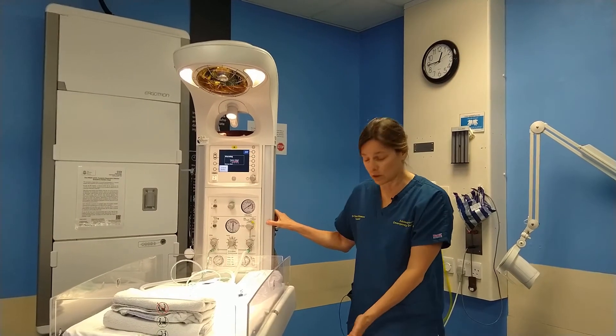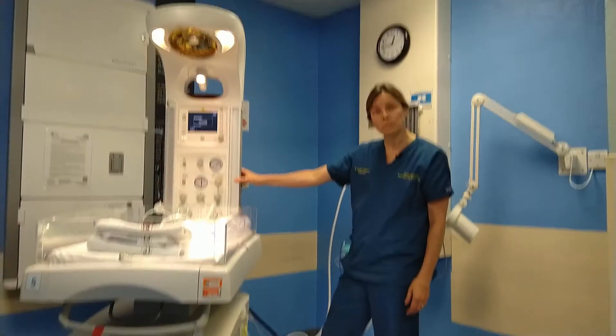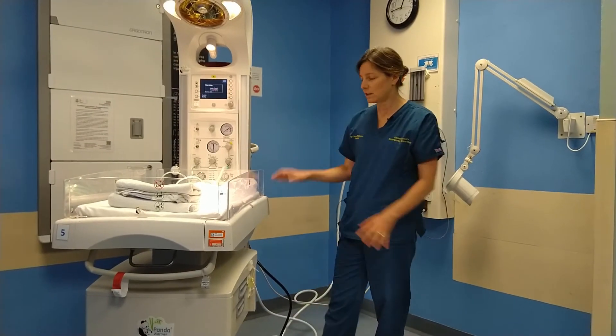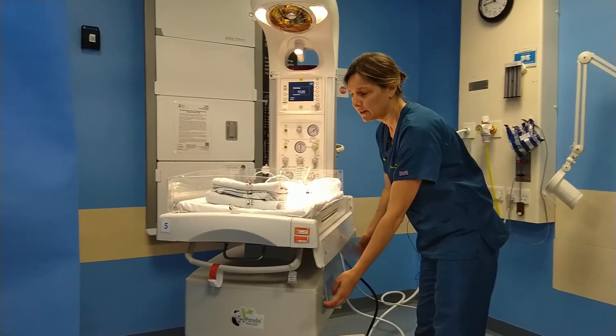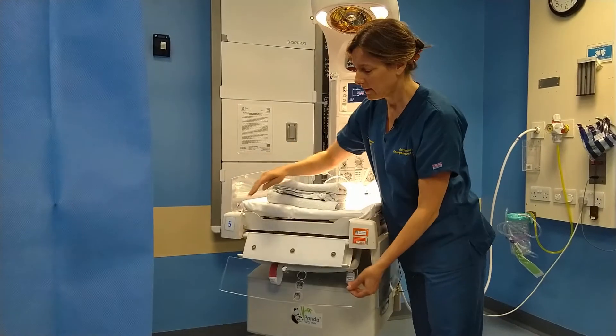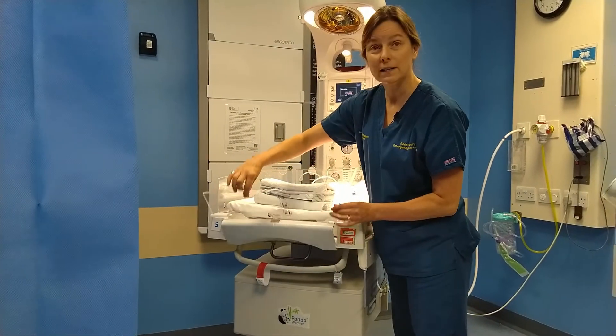The only other two features on the machine are there are pedals so that you can move the machine up or down so that it's at a nice working height, and the sides can be lowered by pulling them up and down so that you can get better access to the baby.